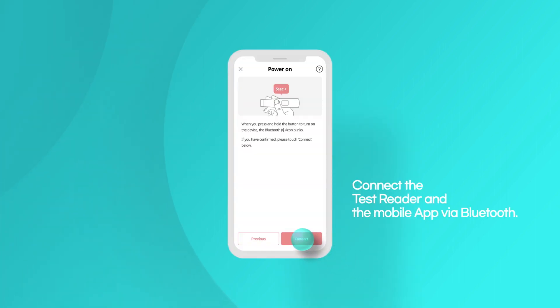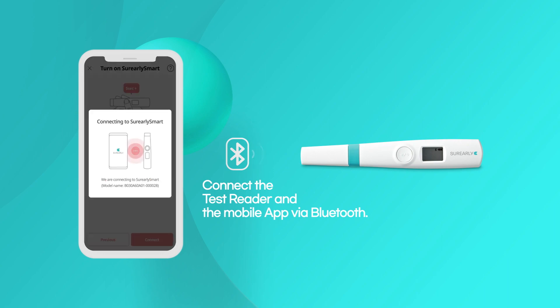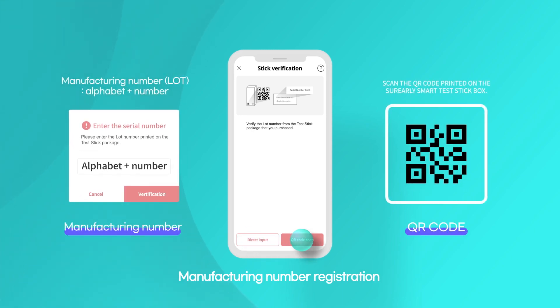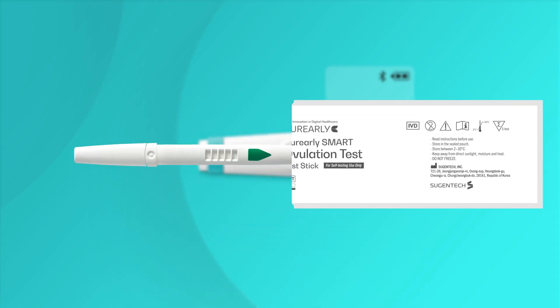Tap the connect button to connect the test reader and the app via Bluetooth. Scan the QR code on the packaging or enter the lot number. When the arrow symbol appears, hold the test stick with the display facing up and insert it into the test reader until it clicks.